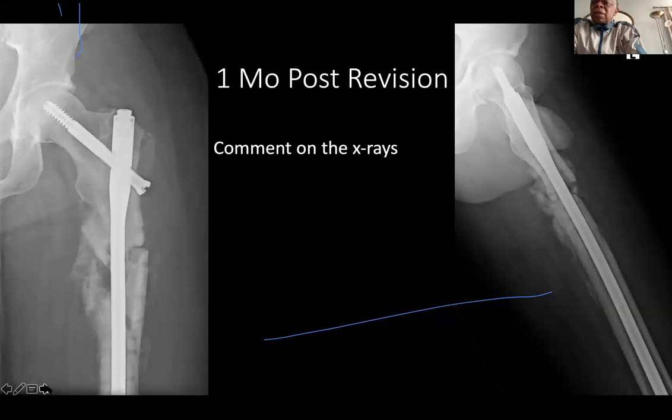Just a comment. Yes, sir. Let everybody be clear. Even if you choose the right implant for these fractures, you can still get a non-union, which is very common. I think the non-union rate is up to about 15% in some papers. The question I've always asked myself is, when you have these subtrochanteric fractures and you've done everything, you've reamed and you've got all this stuff in, can you put in bone graft? What are people's comments on bone graft as an additional insurance?